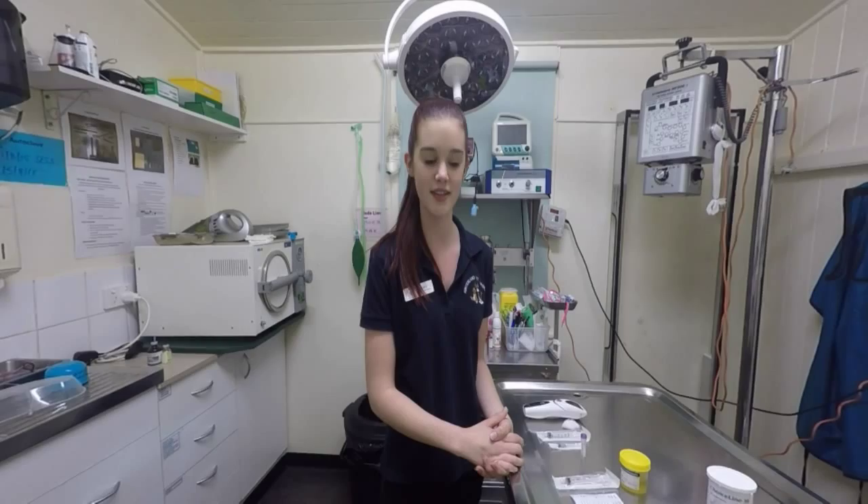Hi, my name is Lucy Graham. I am currently studying Certificate IV in veterinary nursing. My course code is ACMVET403A, Clinical Pathology Techniques Simulations. Today I will be performing a urinalysis and a blood collection from the jugular vein.